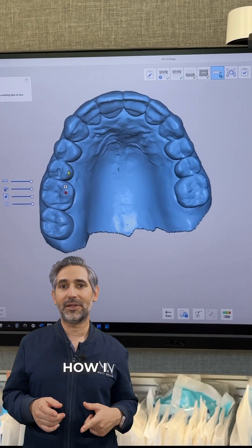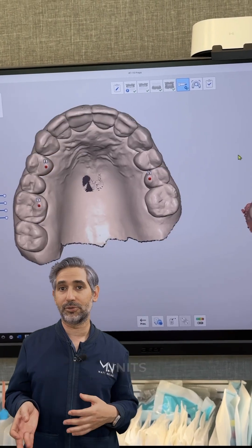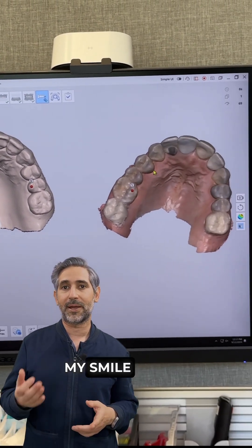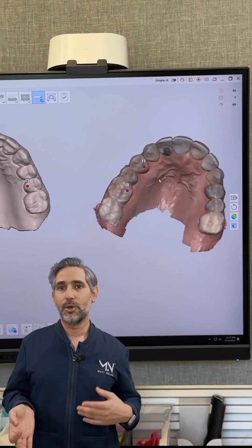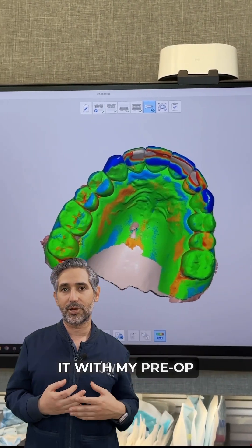In this video, I'm going to share how I like to do my scans for more complex restorative cases for multiple units. What I like to do is always make sure I have my smile design or my digital wax-up within the scan. So I brought in the design and I lined it with my pre-op.